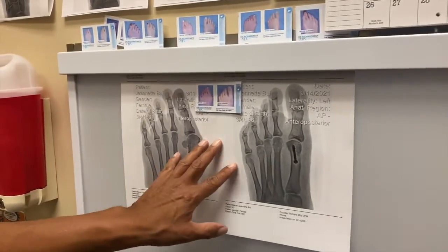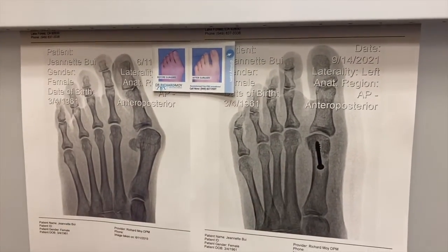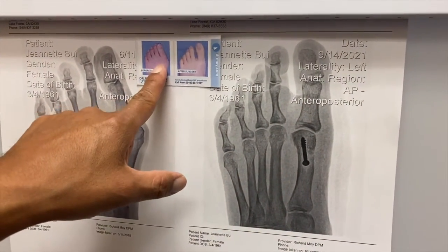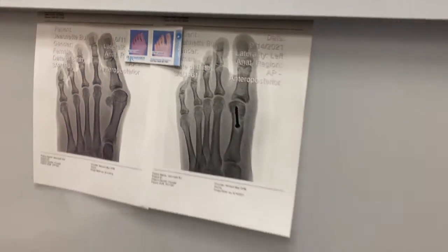Here we have Jeanette, and she just had bunion surgery five days ago. This is her before and after x-ray, and you can see how nice and straight her toe is now. This is the way it looked right before surgery and right after surgery, and now it's again five days post-op.